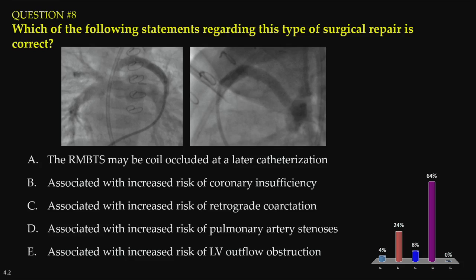So I would say this isn't a BT shunt because a BT shunt would be coming straight down on the lateral from the SVC down to the PAs. So in the lateral view, it wouldn't be anterior to posterior. And as for your catheter course to get to a BT shunt, I guess you could go RA, RV into the aorta and then into the subclavian artery and down, but that's not the catheter course that's shown here. So that wouldn't be a BT shunt.